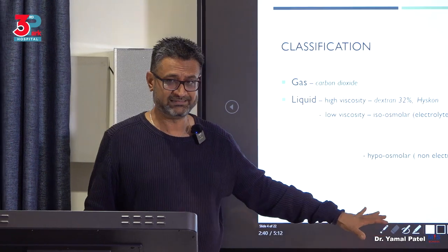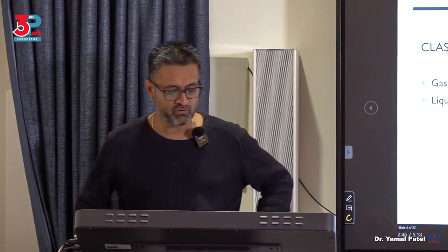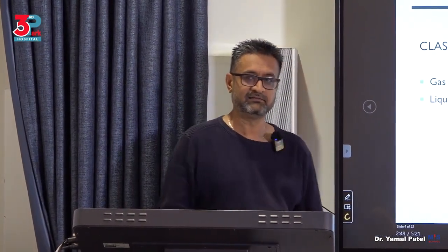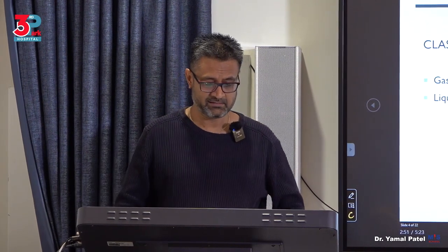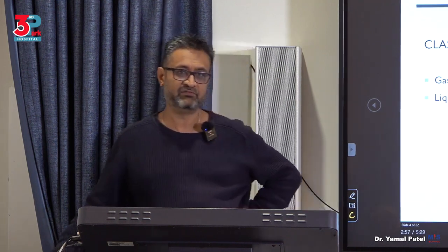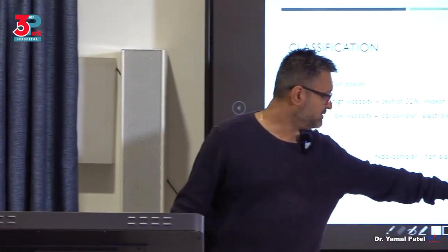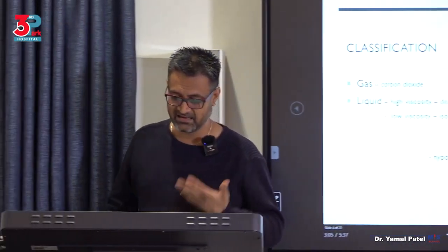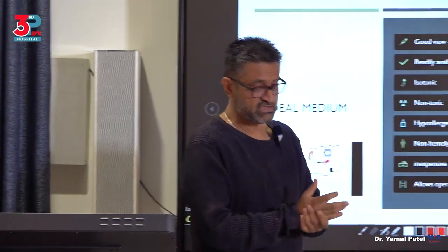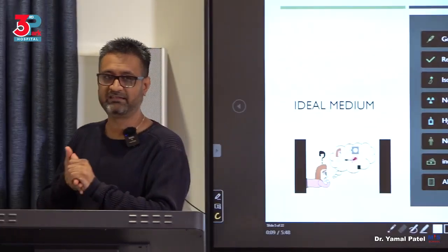These are for understanding, but it's all going to narrow down to only one, okay? Then we have hypoosmolar. Again, these are not electrolytic, or if they are, then they are under the normal osmolality of the solution, of the plasma. So you have glycine, sorbitol, dextrose, etc. Again, you need to understand them and know the complications, but we don't usually use these anymore. I don't use them anymore. Let's put it that way. I know they still can be used, but I don't use them anymore.